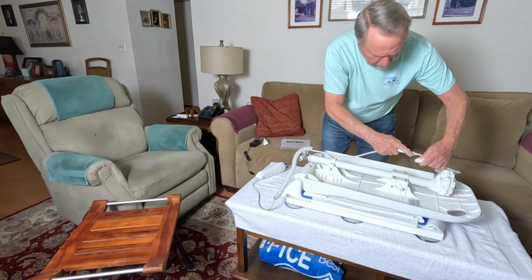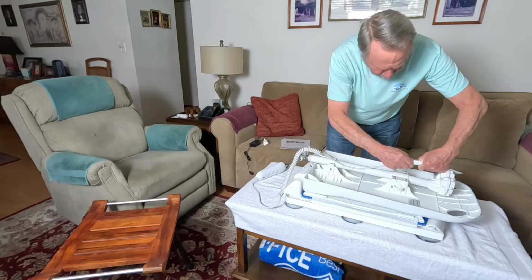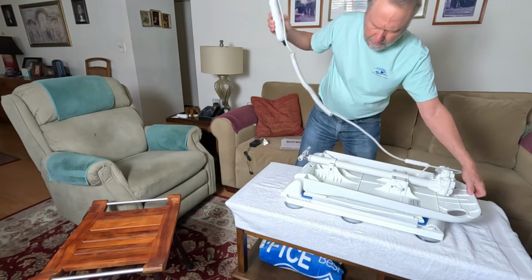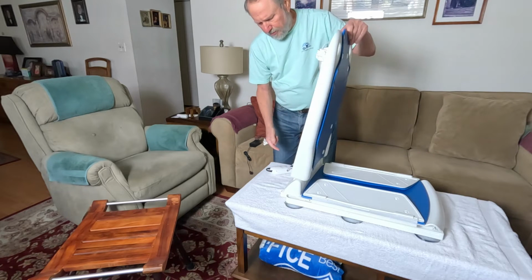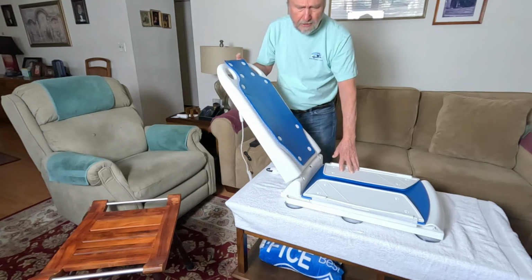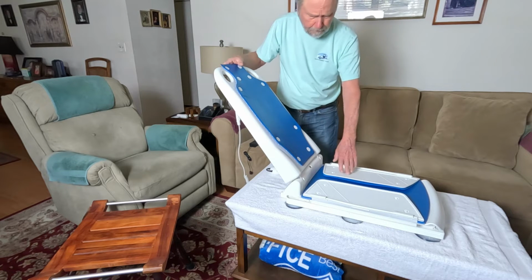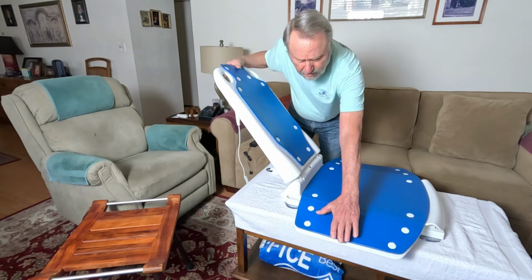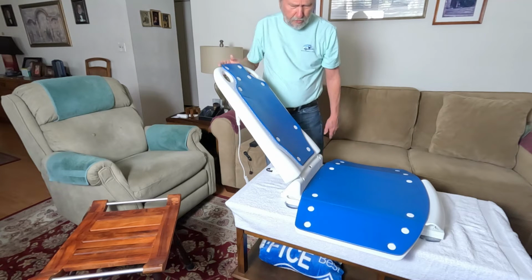Again, this plug has a little flat area, and it lines up with the silver of the remote control. And now we can lift this up to the full position, and this is going to go into a seat, and it doesn't lock, it just goes in there and has a place to rest. So you can just move it back and forth, but it hits a point where it's not going to go anymore. Then you would lower those over, and this gives a little ramp for a person to slide up on, which I'm going to demonstrate here shortly.